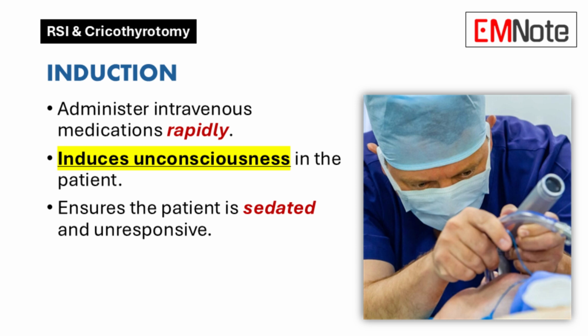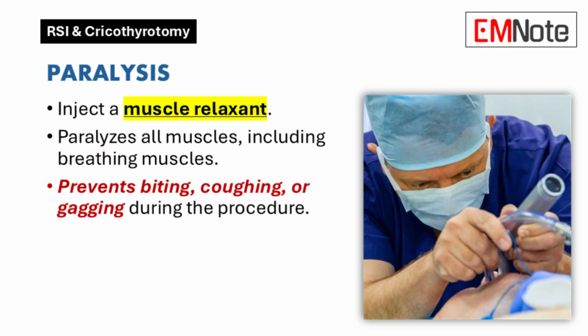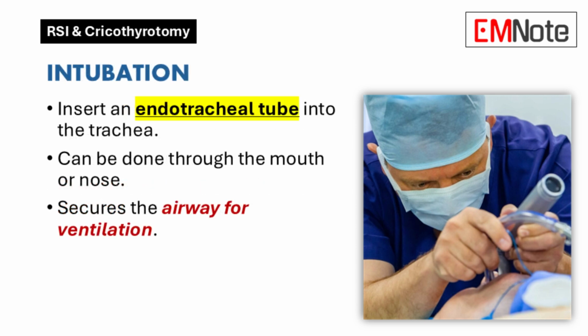So at this point, the patient is completely sedated, unresponsive. Yes. Then we move to paralysis, where a muscle relaxant is injected to paralyze the patient's muscles, including the ones responsible for breathing. So that ensures they remain still, and it prevents any coughing or gagging that could interfere with the intubation process. That's right. At this point, teamwork becomes crucial. A skilled medical team working in sync is essential for a smooth and successful intubation.